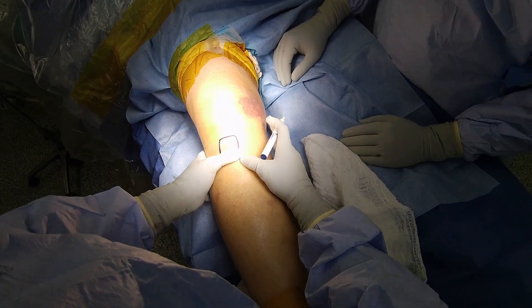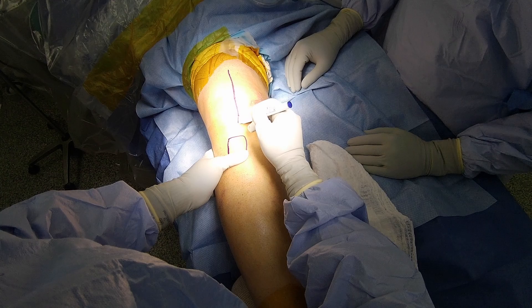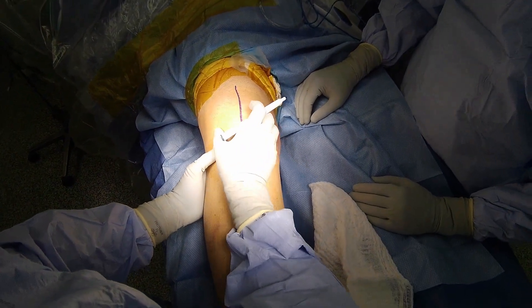He tore his patellar tendon during a fall while bowling. The patient has been prepped with the right patella upwards, given tranexamic acid and antibiotics. A tourniquet was used under the drapes for this case.